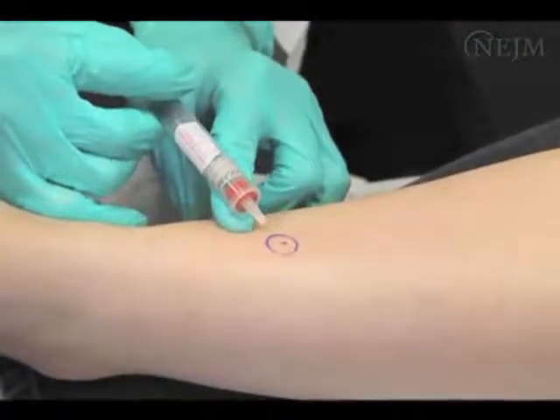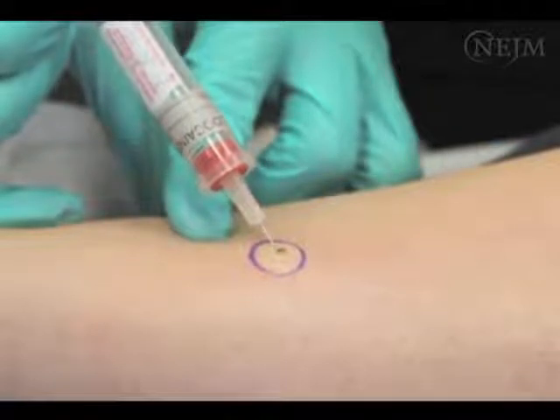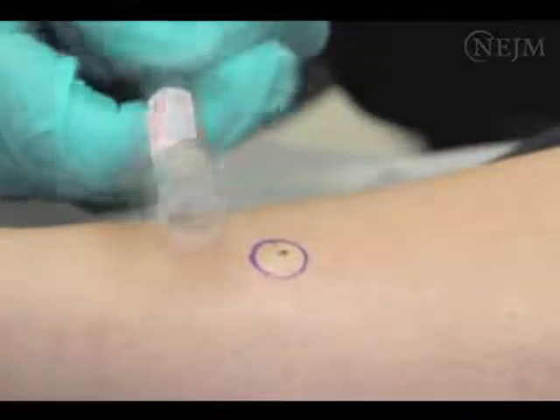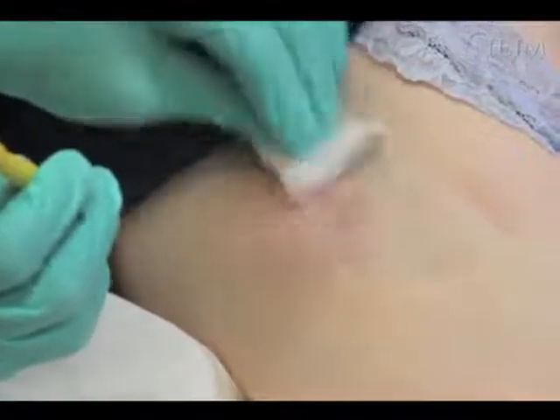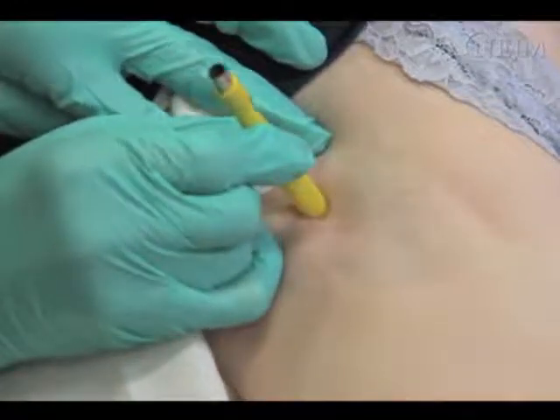Anesthetize the area by inserting the needle parallel to the lesion and slowly raising an intradermal bleb under it. If necessary, while the needle is still in the skin, withdraw it and reset the angle of the tip to anesthetize the area more widely and deeply. The effects of lidocaine are almost instantaneous. In highly vascular areas such as the scalp, lidocaine with epinephrine should be used, and it is prudent to wait several minutes to allow epinephrine to exert its full vasoconstrictive effects. To allow for the most complete sampling of pigmented lesions, make an imprint around the lesion with the back of the punch before performing the biopsy. This imprint serves as a guide for centering the lesion in the punch.